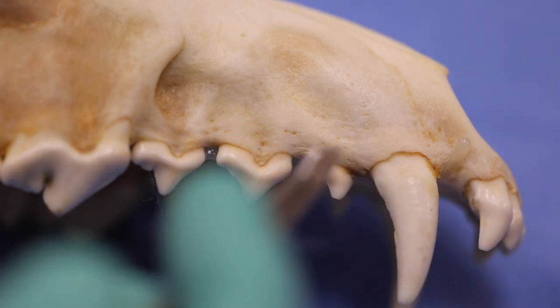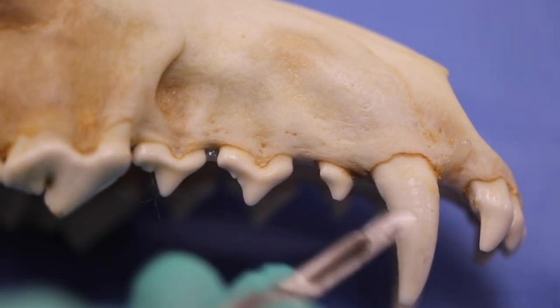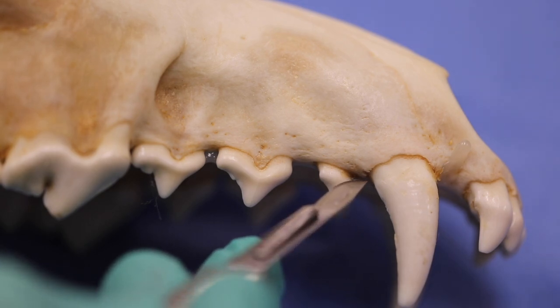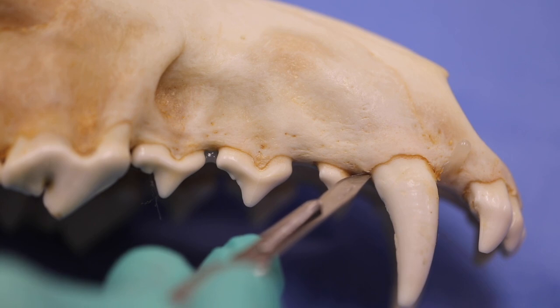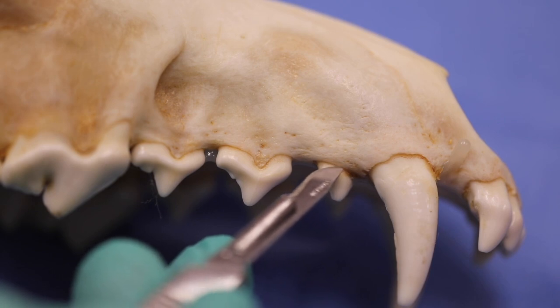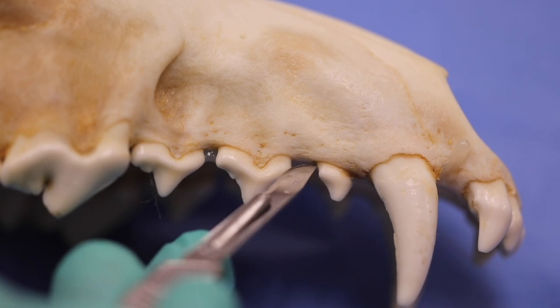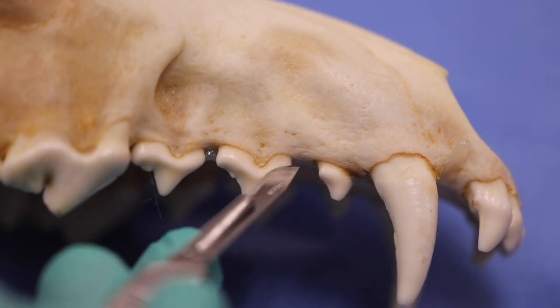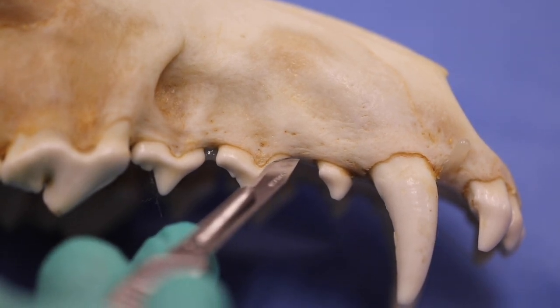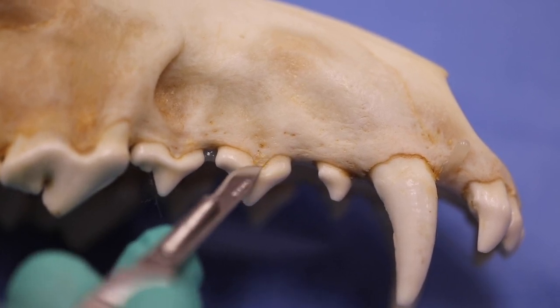So what we want to do is make sure that when we make these little stab incisions, we start at about a 15-degree angle, and we go at the margin of the gingiva and we take it up underneath that gingiva in the sulcus, and then we make these little stab incisions as we go. And having at least a 15-degree angle, what we're doing is we're pressing that down, we're going through the junctional epithelium, and we're landing on that marginal bone.